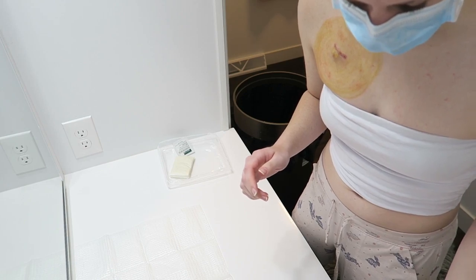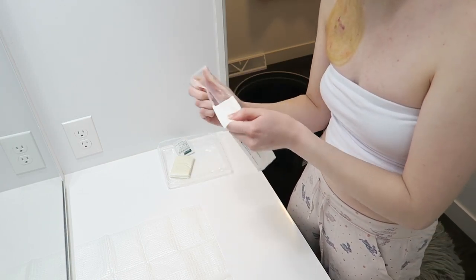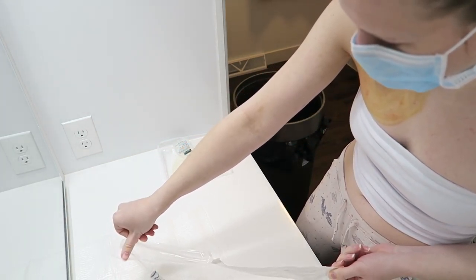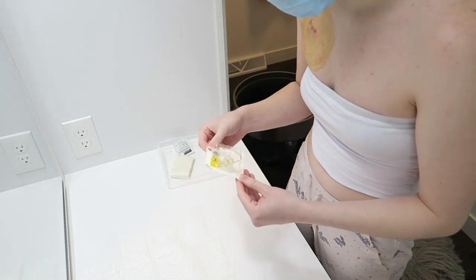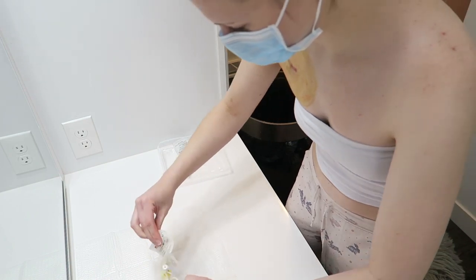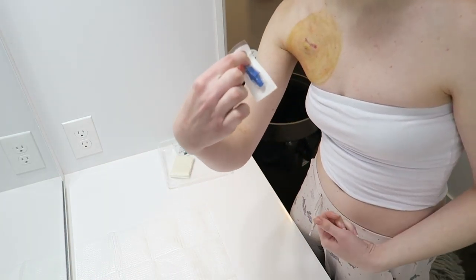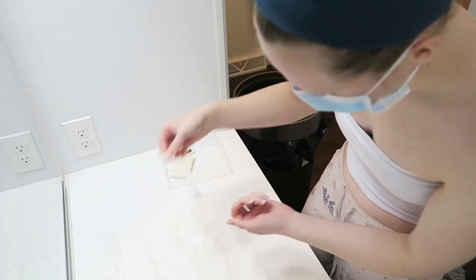Next, we need to put everything else on the sterile field. So like this, the saline flush. Then we're gonna go ahead and get our needle. There we go. Then we're gonna open our clave connector, and you can pinch it from the outside so you can hold on to it and then dump it on.